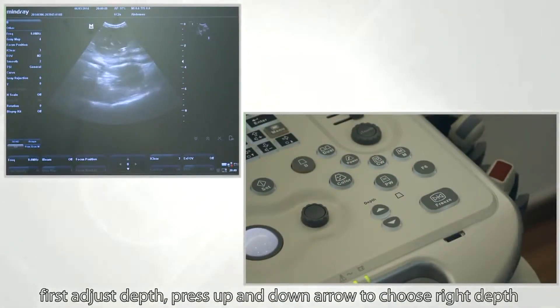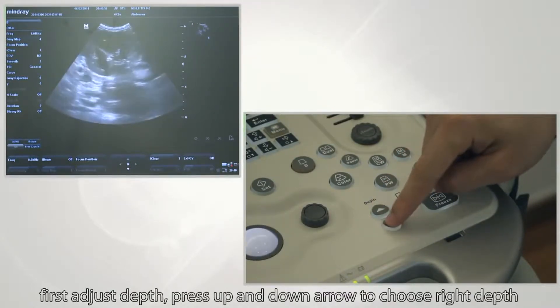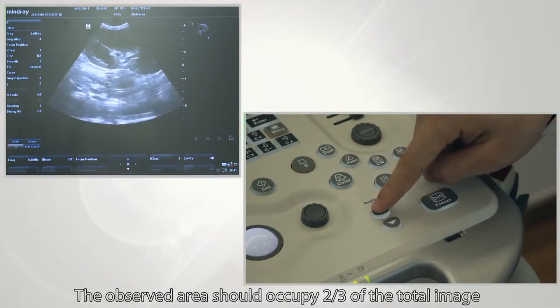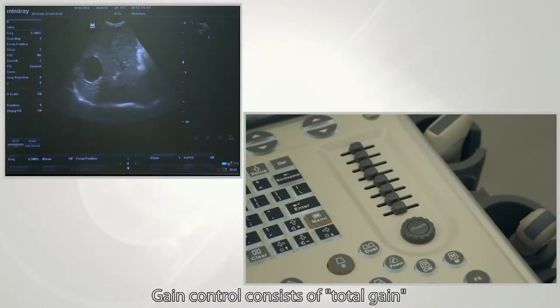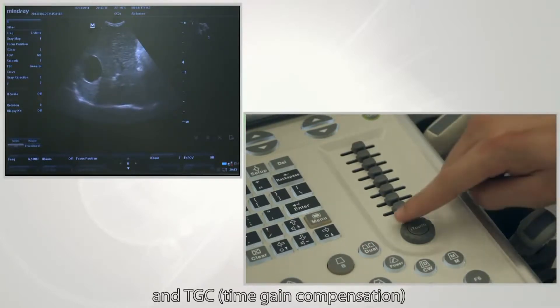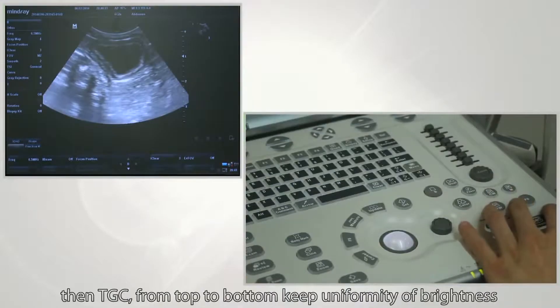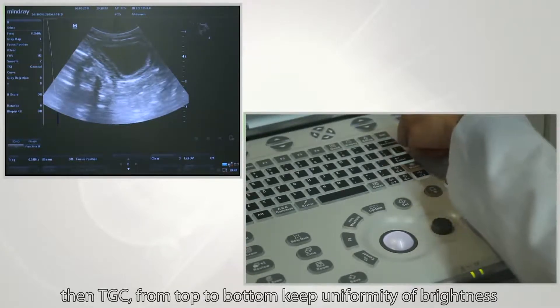To adjust depth, press the up and down arrows to choose the right depth. The observed area should occupy two-thirds of the total image. Gain control consists of total gain and TGC, which means time gain compensation. First adjust total gain to make sure the image is not too bright or too dark. Then adjust TGC from top to bottom.